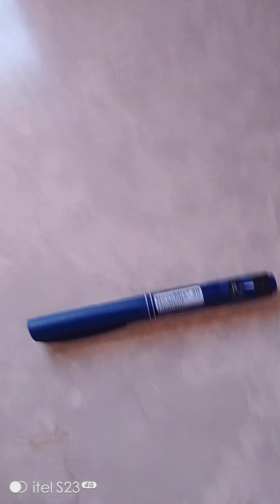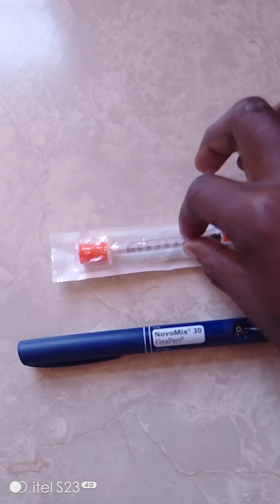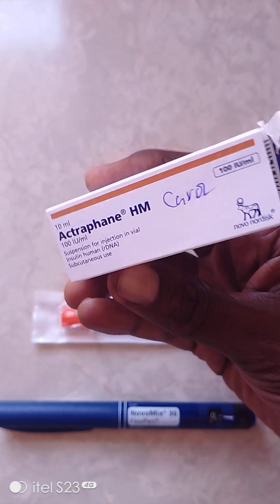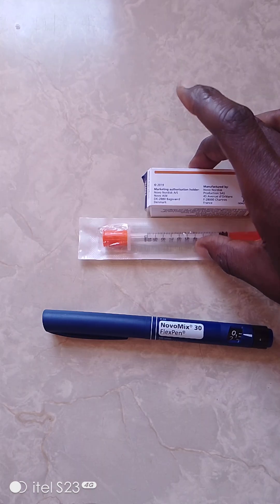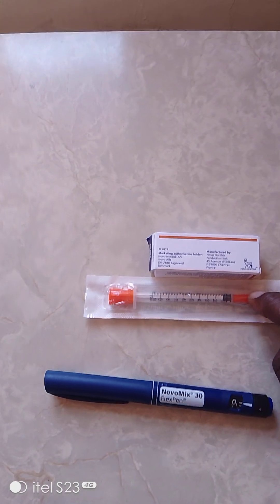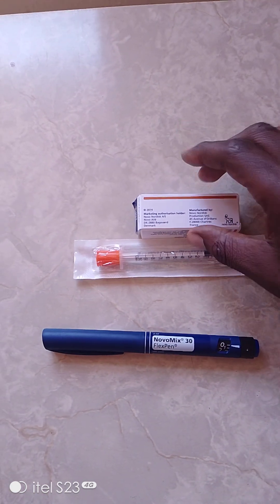This is what I'm talking about - this is the flex pen. This is the ordinary injection that we have, and this is the insulin. Some people move with insulin just like that. Most people would be moving with this set while traveling, and they withdraw from there using the one mil needle or 100 units needle and syringe.